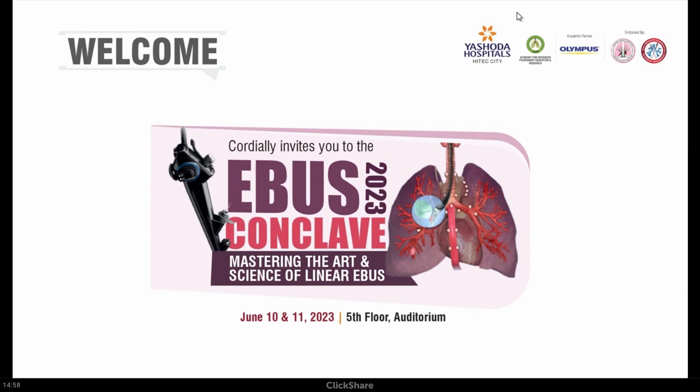Yes, so by ROSE, it is not one node. So we sample all the nodes, and even if one node shows a diagnosis, that is sufficient. The other thing is, whichever node shows material, that node you will take for ancillary studies. So whichever node has the maximum granulomatous yield or maximum atypical cells, that node you will sample for the accessory tests. So if you want to take a genetic test sample, you also ask the pathologist which node has the maximum material, maximum yield, and that node you will sample. So ROSE actually helps us in diagnosis, triaging for the need of biopsy, and also triaging for which ancillary test to be done. I think all of these are there.